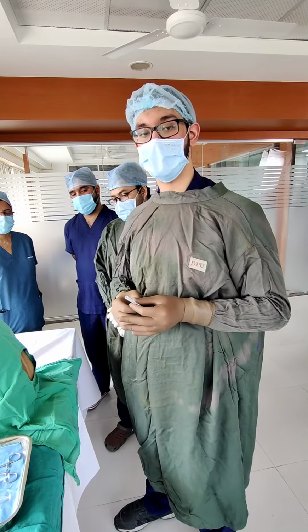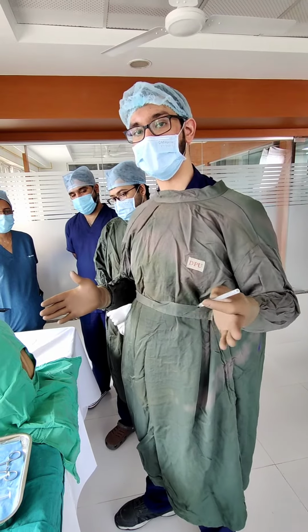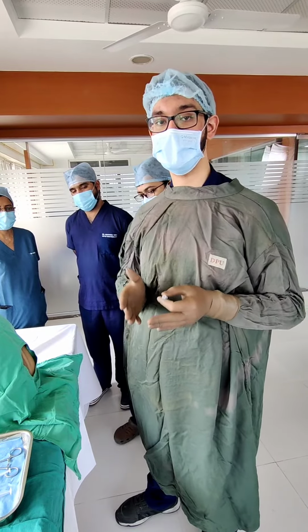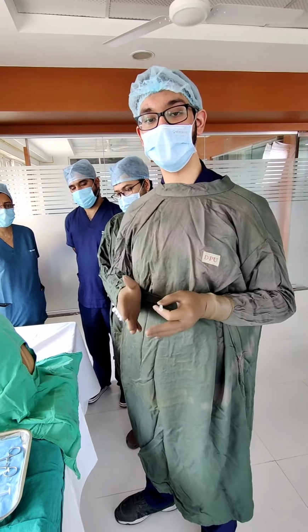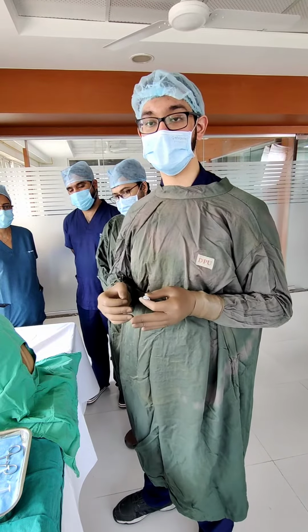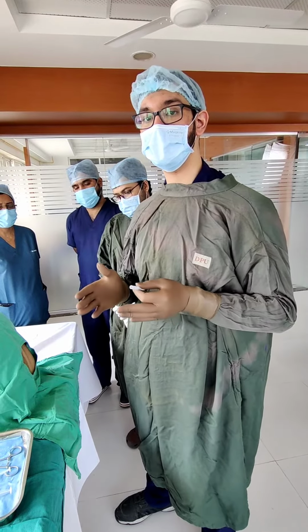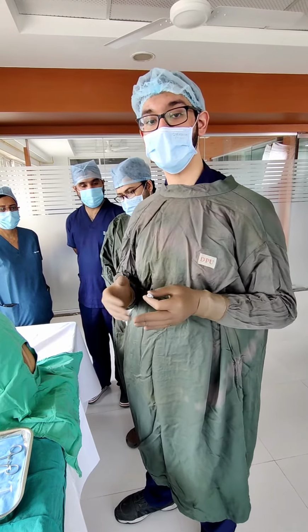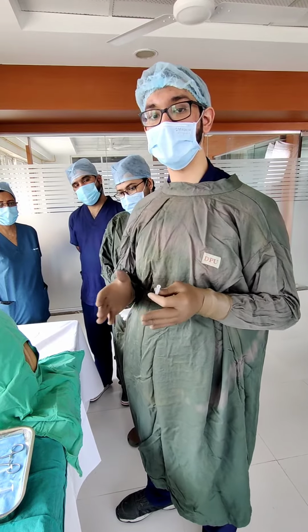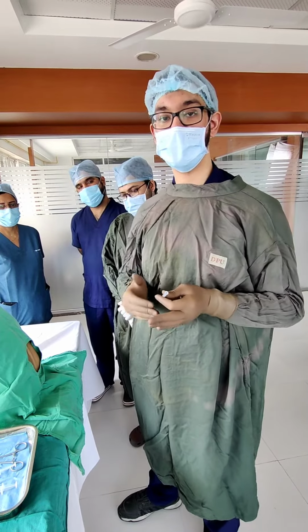As we introduce our spinal needle, the layers pierced from outside to inside will be skin, subcutaneous tissue, supraspinous ligament, interspinous ligament, ligamentum flavum. As we pierce the ligamentum flavum, we'll have a loss of resistance followed by the epidural space. As we advance our needle, we'll pierce the dura-subarachnoid membrane. That will be the second pop-off, followed by the subarachnoid space. As we reach the subarachnoid space, we'll have free fluid, that is the CSF, flowing through the needle.